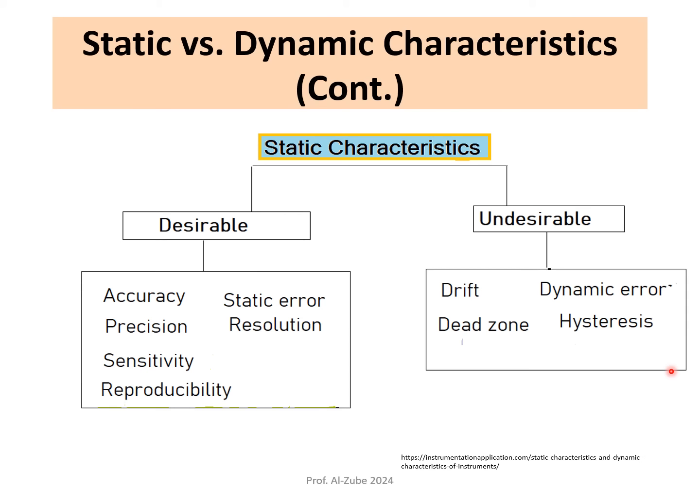So, for example, when a thermometer is exposed to an increasing temperature, the temperature reading on the thermometer will lag behind the actual temperature if you change it to low temperatures, right? This is the hysteresis of the measurement that we're looking at.